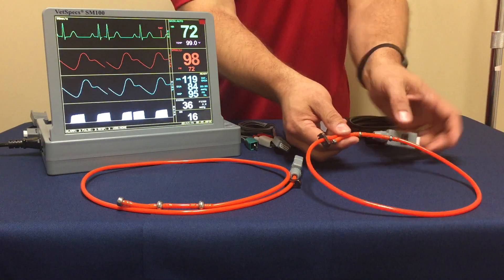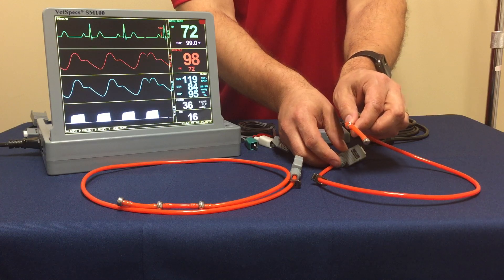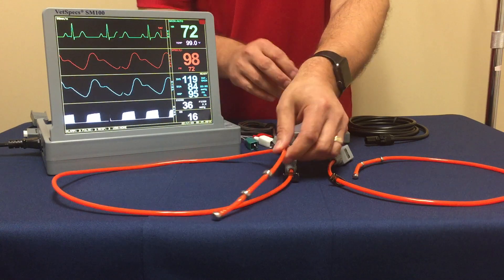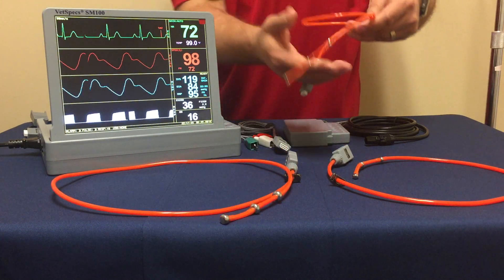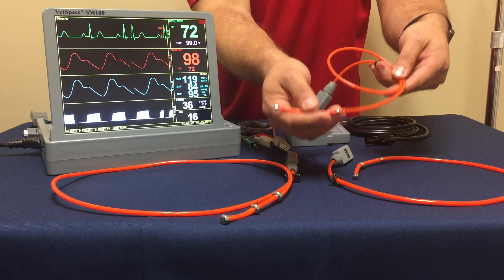Standard with the monitoring systems are a cat and small dog esophageal probe and then their medium to large dog probe. They do offer an optional kitten and puppy probe and just know that that is available.